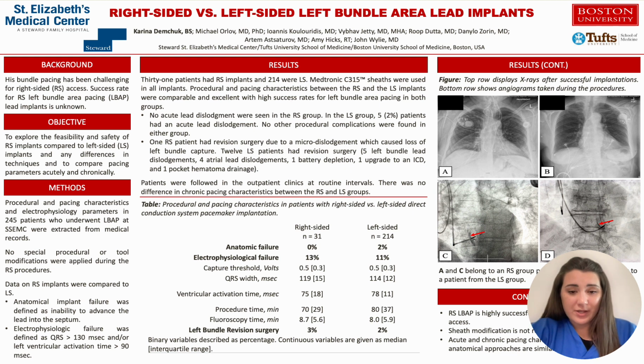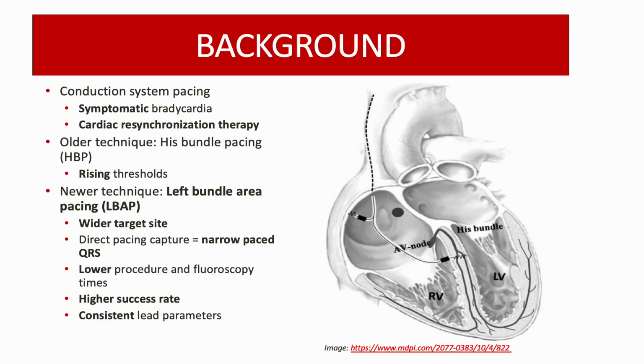I work in the cardiology department at St. Elizabeth's Medical Center, and today I will be discussing right-sided versus left-sided left bundle area lead implants. Before jumping into my project, I'd like to take a moment to familiarize you with conduction system pacing.